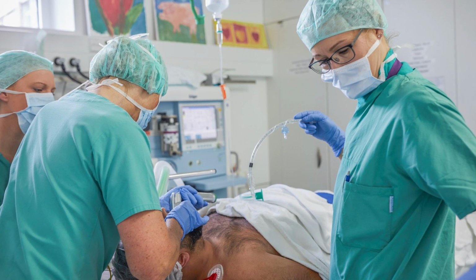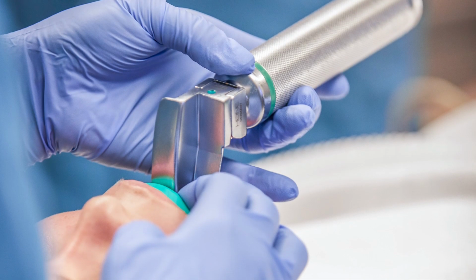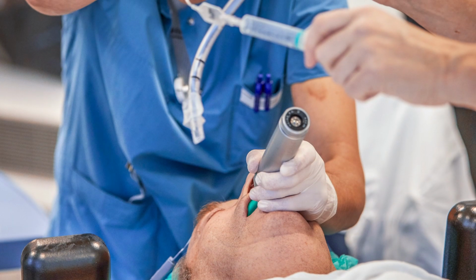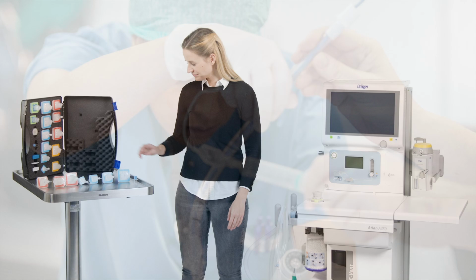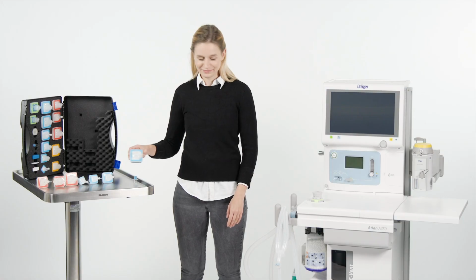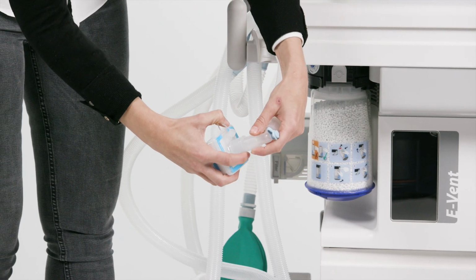In high-flow anaesthesia, the lower airways are often overwhelmed with the introduction of cold and dry medical gases. Mechanical ventilation can cause damage to the lung parenchyma using a high flow of fresh gas. To avoid this, we recommend using the TwinStar HEPA Plus, a combination of filter and HME. Alternatively, the TwinStar 55 Plus can be used.